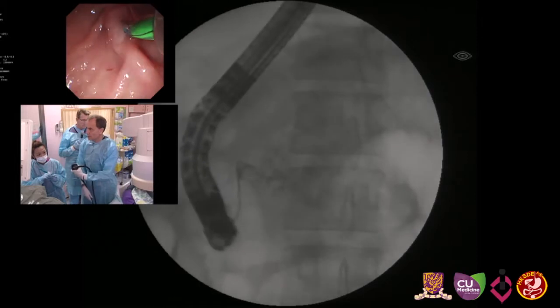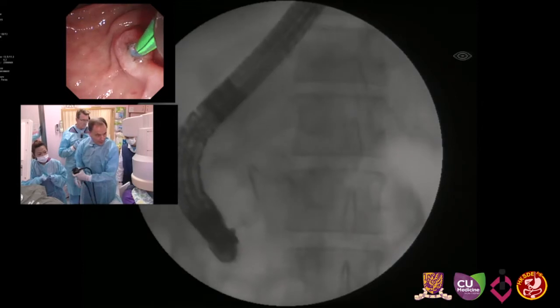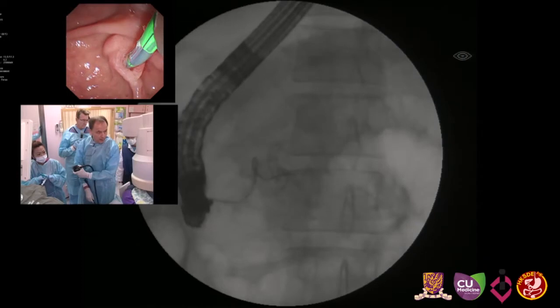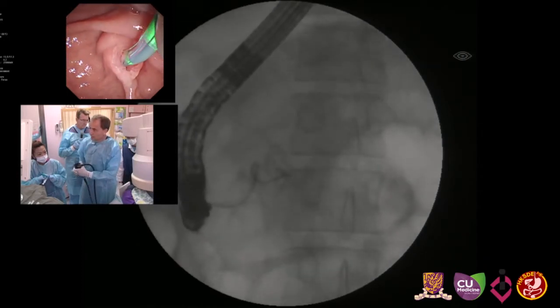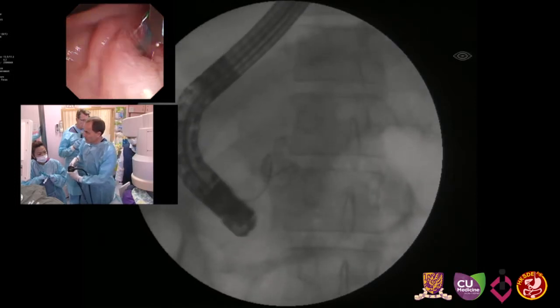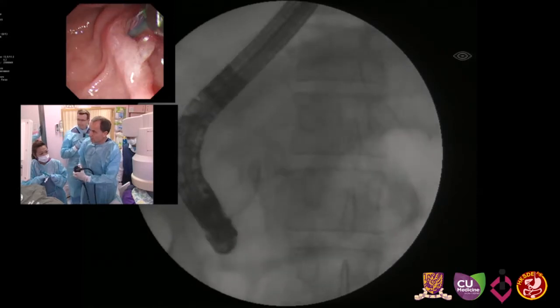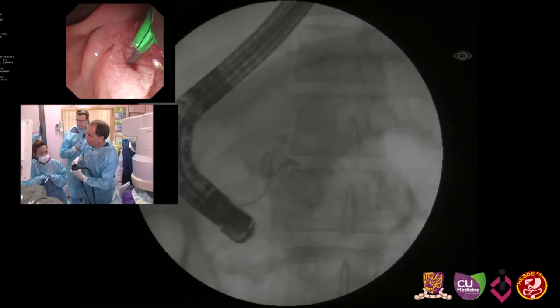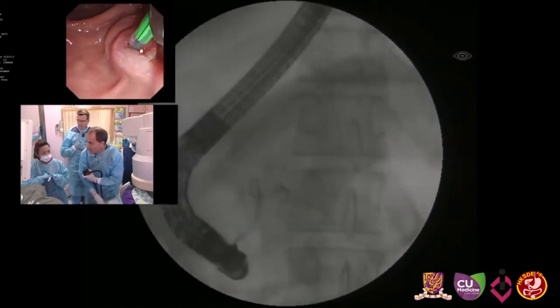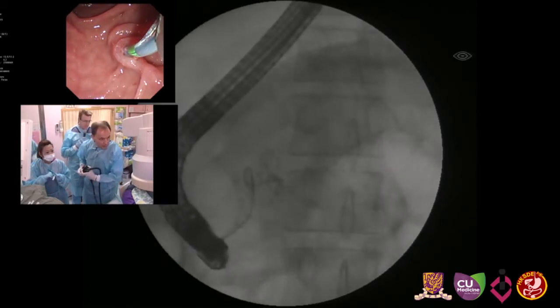So I cannot pass it alongside the stone. So again, I pull the scope back. Otherwise, we could already do sphincterotomy at this stage. Now, yeah, I'm a little bit deeper inside. You see my maneuvers with the endoscope. But with a sphincterotome, I can probably not pass the stone. Okay. Push, try to inject a little bit.